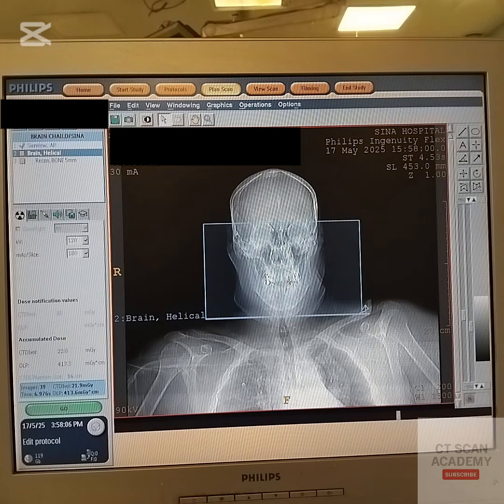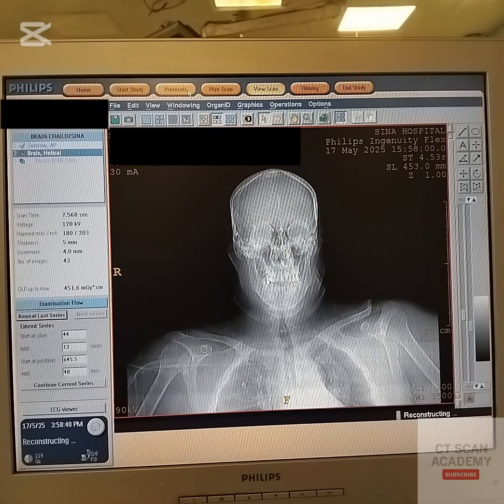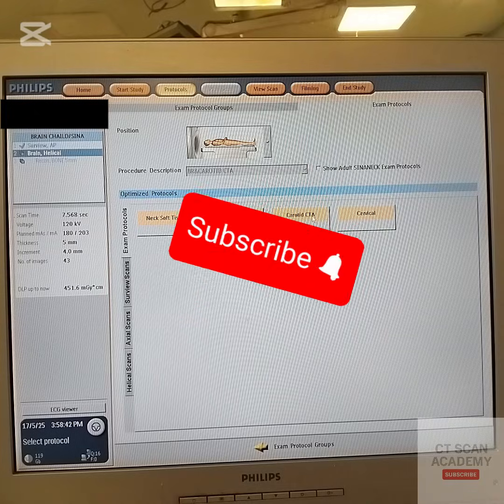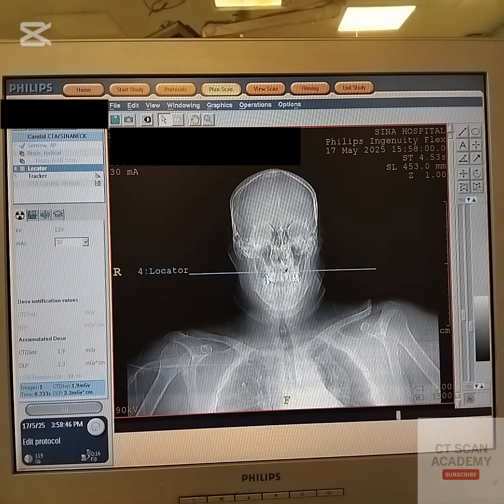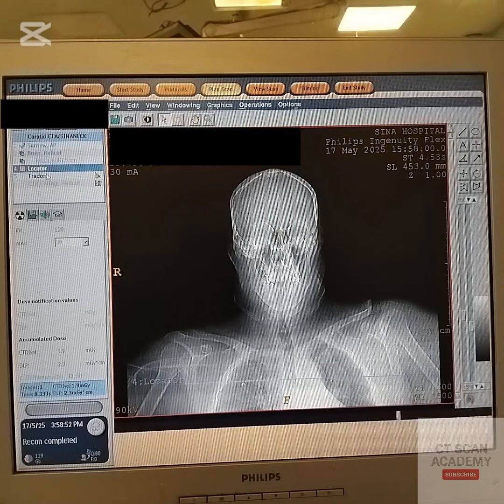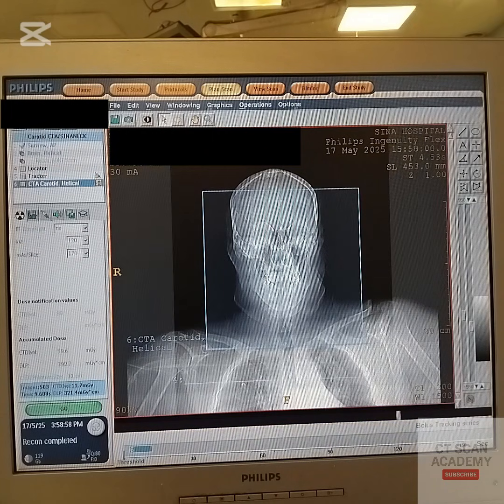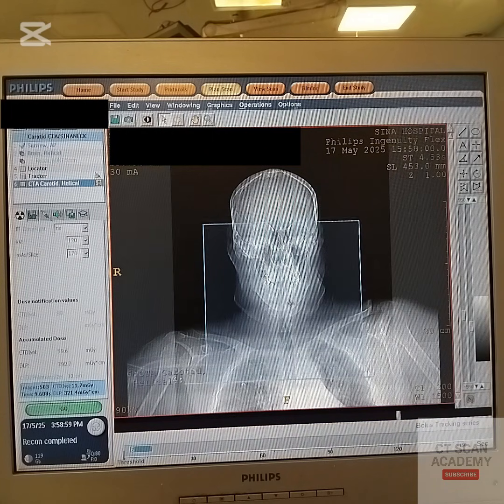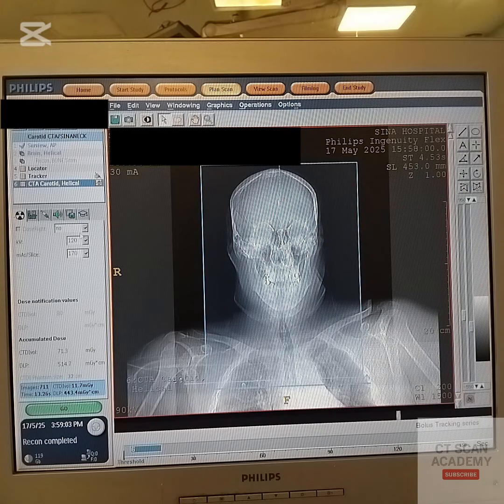Use a 180-degree survey. After the survey, place the locator at the aortic arch. The tracker will auto-align. Set the scan box from the aortic arch to the top of the vertex.